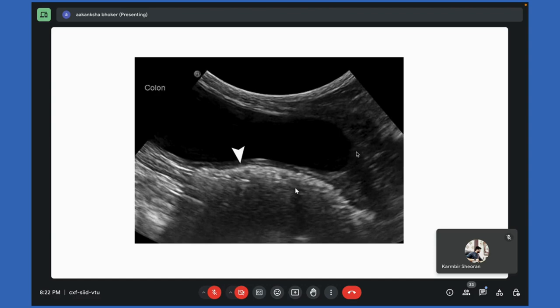I'm asking about the uterine body, the horns, and the ovarian attachments like the suspensory ligament and broad ligament. Can we appreciate them on USG without any pathology? In normal cases, in most of the cases, I have never seen any pathology generally associated. But definitely there are some lymph nodes associated with them, and if any associated lymph node is enlarged, that can be seen. Some visceral lymph nodes, if they are enlarged, can be seen.